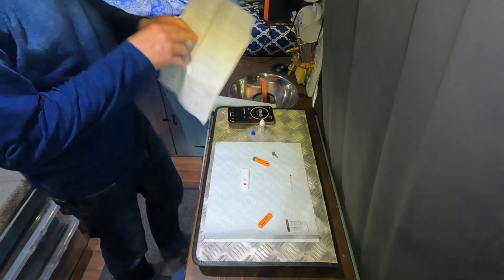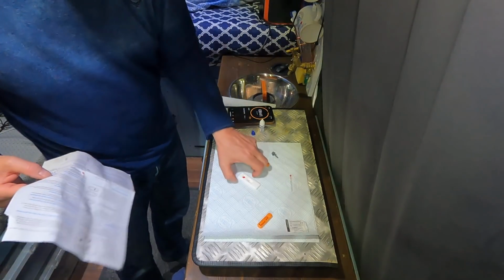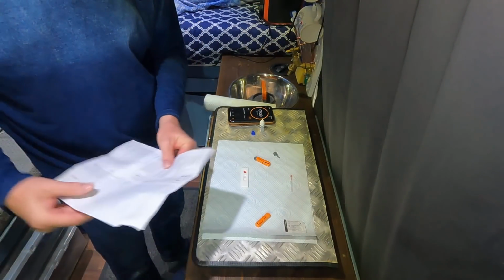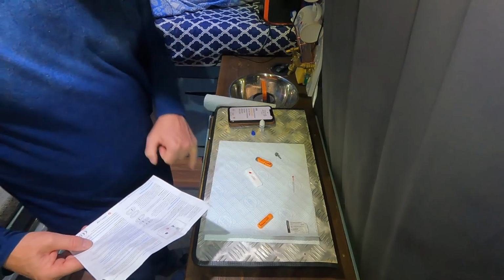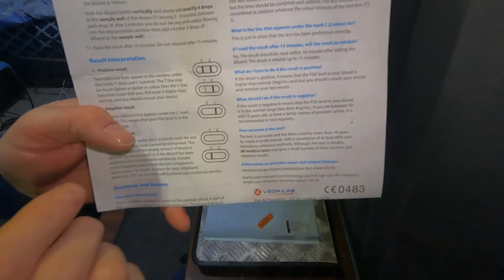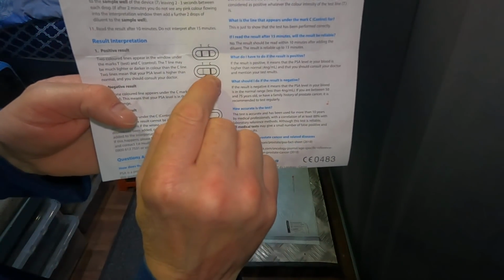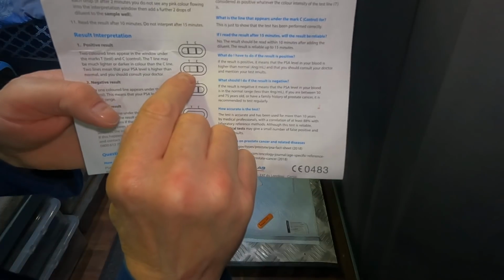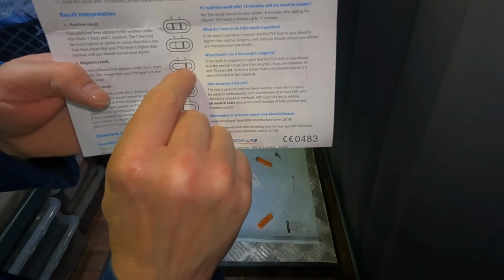Right. I've got it around all the way. Should be that way around. So I can see a line already forming on that C. So on here we have, if it's 2 lines it's positive. If it's 1 thick line and a faint line, it's still positive. What we're looking for is 1 thick line above the C.